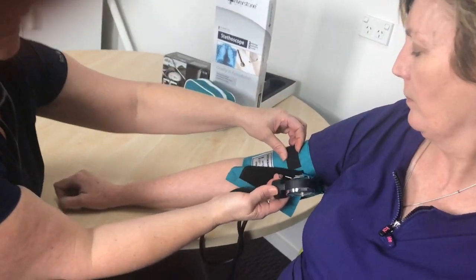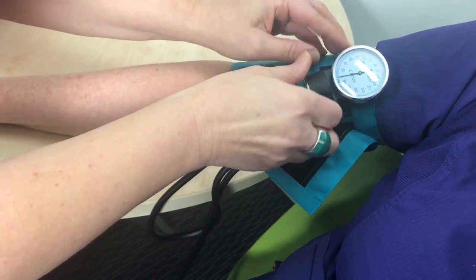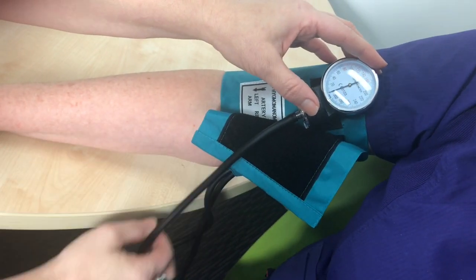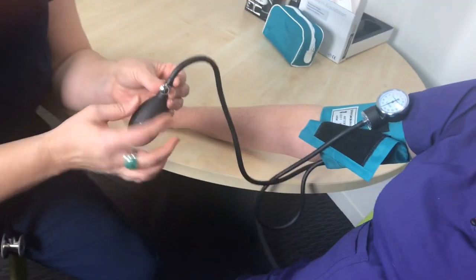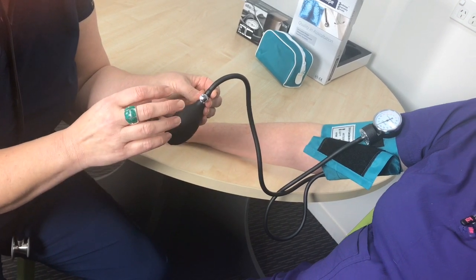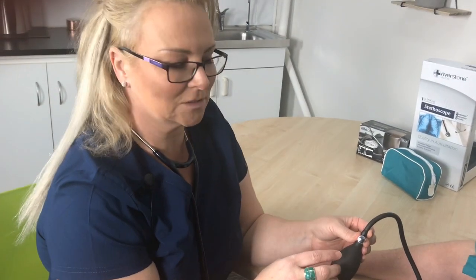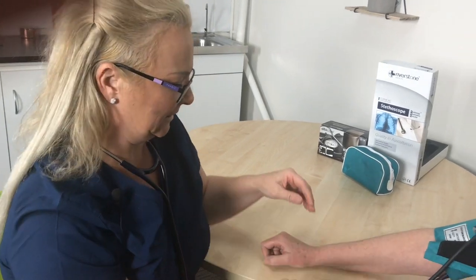You can actually put your gauge in here if you want to, or you can just lay it on the bench, whichever is easiest. The first thing you have to do is the little wheel here — make sure that's turned all the way to the right. There's an expression: righty tighty, lefty loosey. So to the right is completely closed.